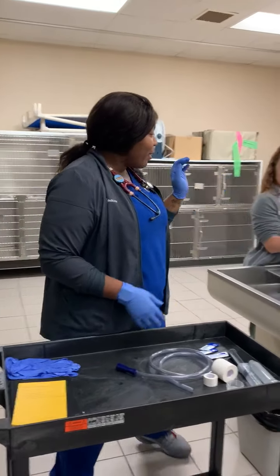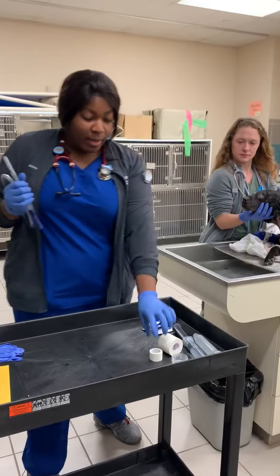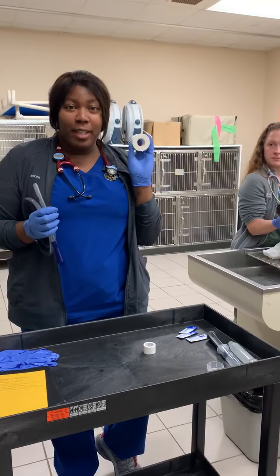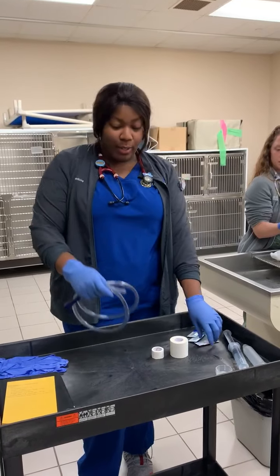So we have our patient here. The first thing we want to make sure we have everything that we need. So we have our tube, we have our tape for our marker, we have our mouth speculum to hold the mouth open, and we have our syringe so that we can double-check and make sure it's in the right placement, as well as we have our loop.